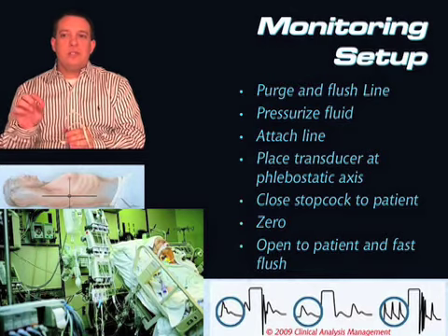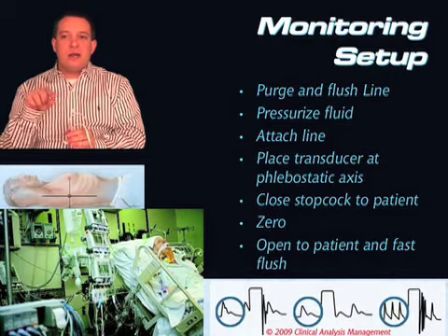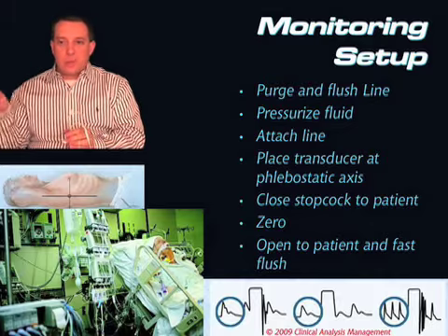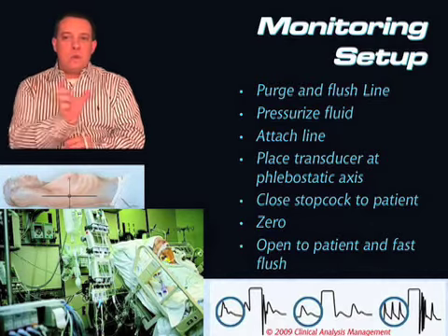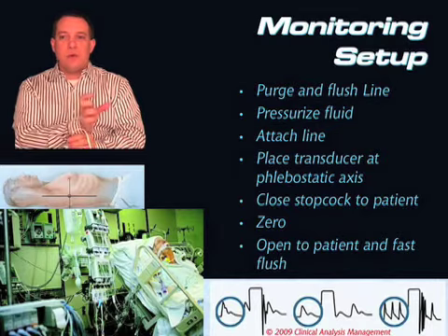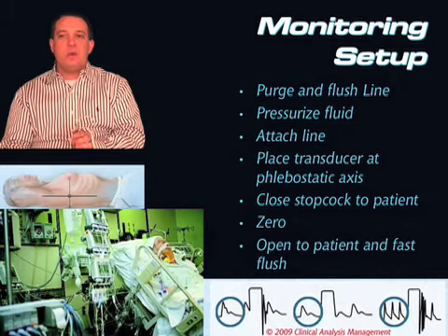When we look here at these three waveforms along the bottom, you'll see that you've got a cardiac cycle, then a sharp upstroke and plateau, then a couple of bounces, and we go back into the first cardiac cycle. When we look at the waveform all the way to the left, that is perfect damping. That is exactly what we want to see.